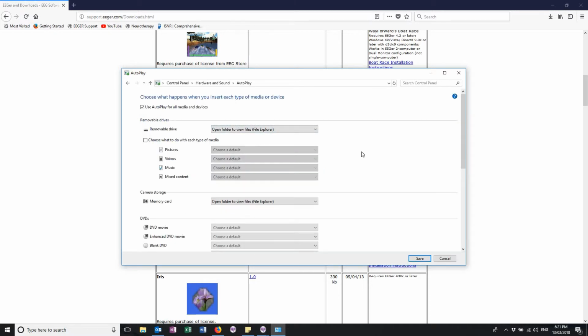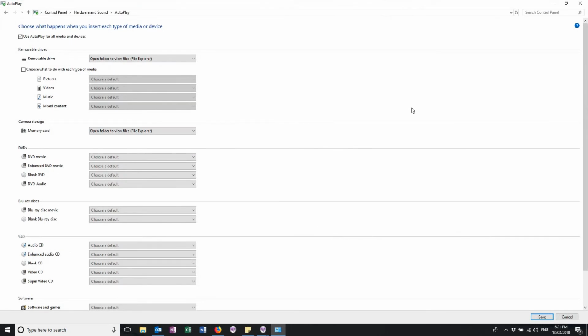So what this is here is you're deciding what happens when you plug in a USB stick or you put a DVD into your computer, things that'll happen automatically. So I'm going to enlarge this. So removable drives I don't really care about. What I care about are DVDs. So what you should do for DVD is take no action.